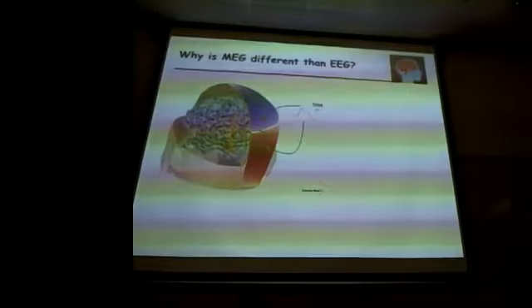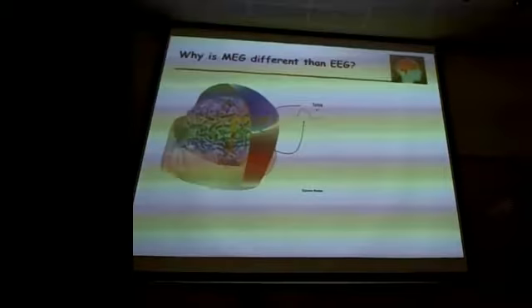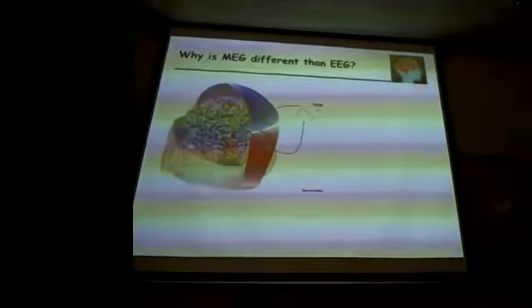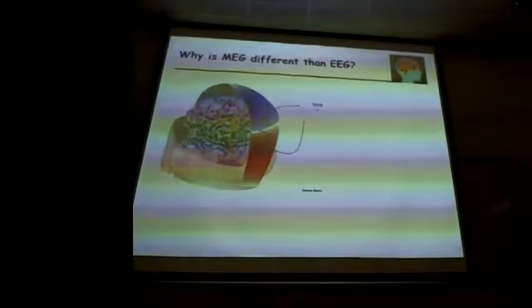So that's what I'm trying to show here. There's this neural current in red, and that generates magnetic fields, which are shown as green lines. Then the extracellular current, which is what EEG essentially measures, is shown in these yellow lines. On the right side, these yellow lines are a little bit distorted relative to the yellow lines on the left side.